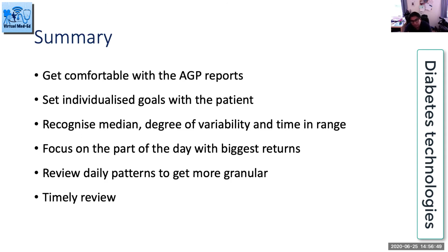Always set individualized goals, and that's your time in range based on the consensus guidance. Always recognize what's the median, that's your dark line, what's the degree of variability, and look at the time in range. And I always would keep it simple, focus on the part of the day that gives you the biggest return, and then come back and see whether you need to change more.